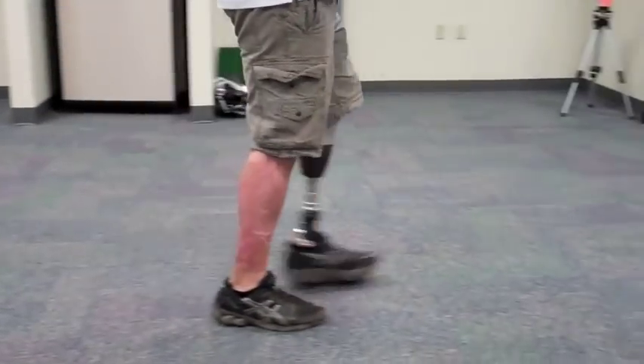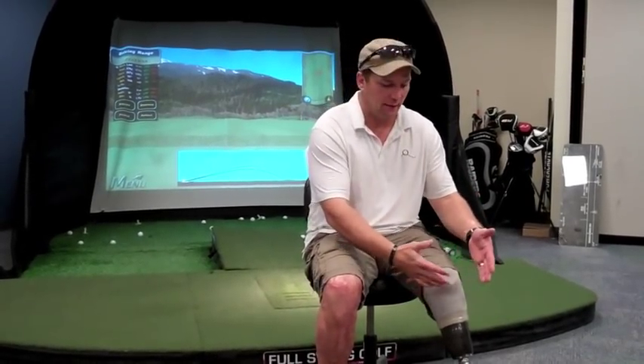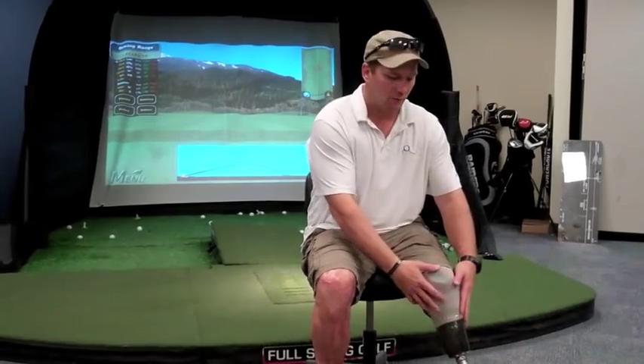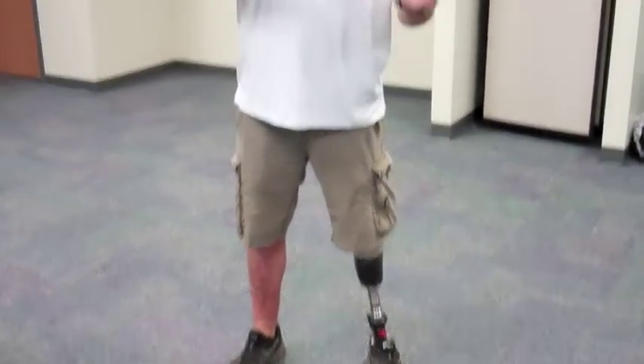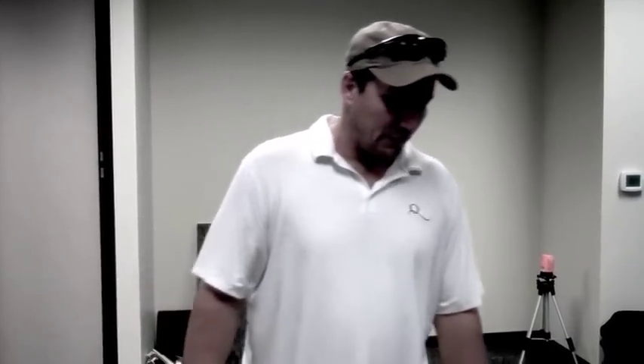Ultimately it doesn't matter how much treatment we applied if we didn't unlock the secret for my particular stump and prosthesis. This one is the Triton. It's been about a month, and the old socket they just took off of this leg was the same one I had before — within a week it was already tearing it up.